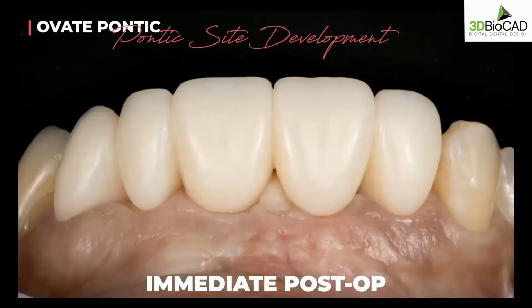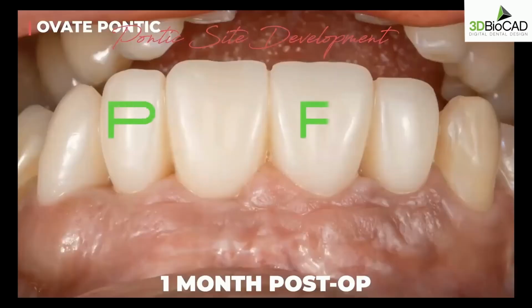And as you can see, there's a little bit of blanching, and that's what we want, right? We don't want to adjust the soft tissue too much that there's a gap underneath the pontic. That's not what we want. We actually want a slight compression so that we get a little bit of blanching. And what this will do is it'll actually push the soft tissue into the interproximal area and buccally so that we get a pontic that looks like it's coming out from the gingiva. So of course, the soft tissue is a little bit irregular at this point, which will need to be plastied later. But if you look at the pontic itself, it looks like it's coming out from the gingiva. So it actually looks quite good.